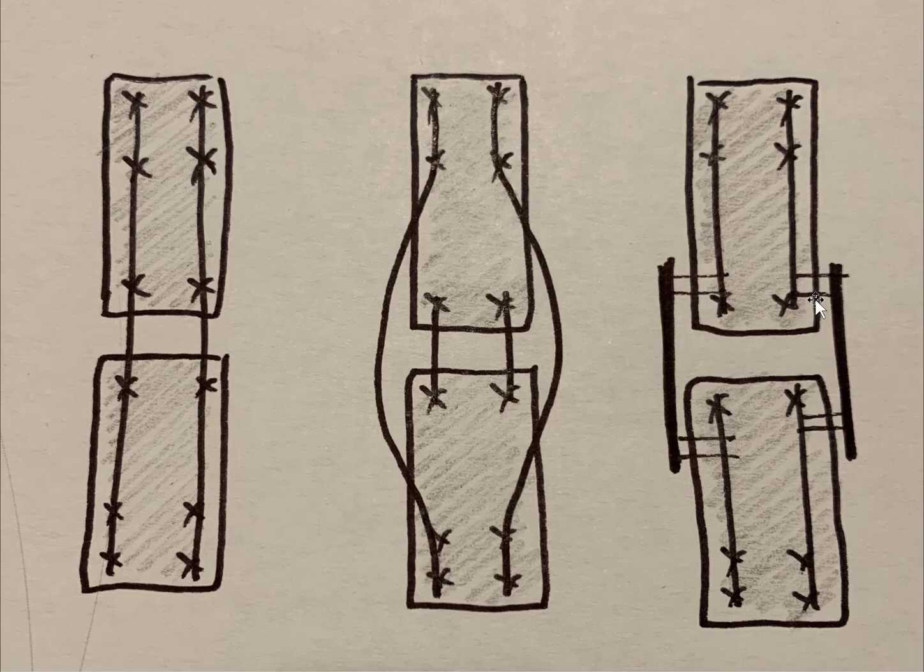This is just different ways that you can instrument pedicle subtraction osteotomies. The first one on the left is basically just one rod. I think of the spine as 2 blocks, the superior portion and inferior portion, and usually you have 6 points above, 6 points below, and you can just use one rod, very simple to use. You want to make it easy and fast. The satellite rod, I think, is helpful if you have very strong pedicles just above and below the pedicle subtraction osteotomy, and you can close it down with the short rod, and then the 2 satellite rods give you extra strength, and cross-linking them is a good idea.